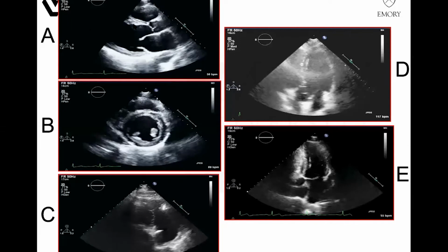So A is the parasternal long axis view. We all know that. Clockwise rotation gives you B, which is the parasternal short axis view. And C is actually the RV inflow view. This is the right ventricle. This is the right atrium. Tricuspid valve is right there. So that's C. So that's correct.